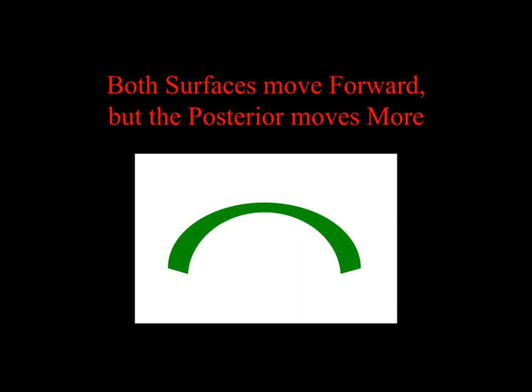This is a very simple concept that I think really stresses the importance of being able to measure the anterior, but particularly the posterior surfaces. Both surfaces can become ectatic, but the only way you can get thinning and steepening is if the posterior surface moves more. If the anterior surface moved more than the posterior surface, you would get thickening.